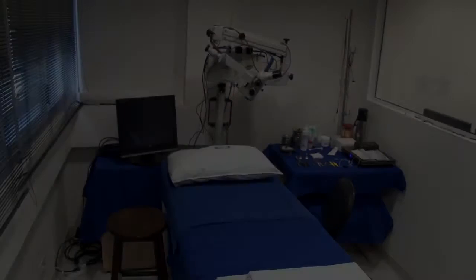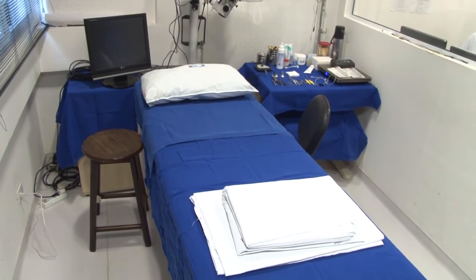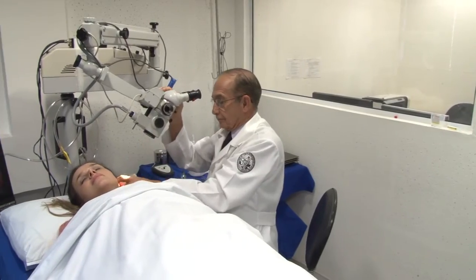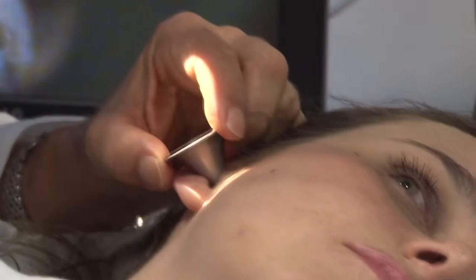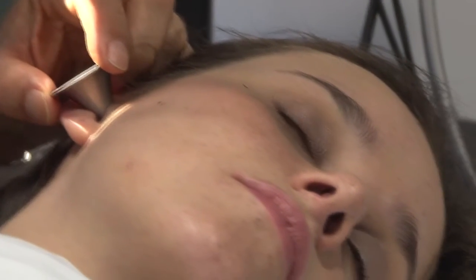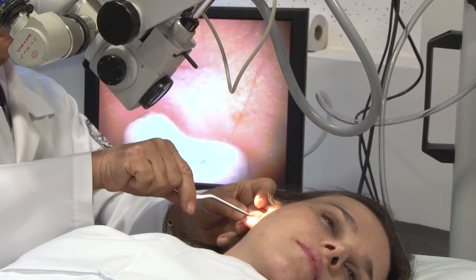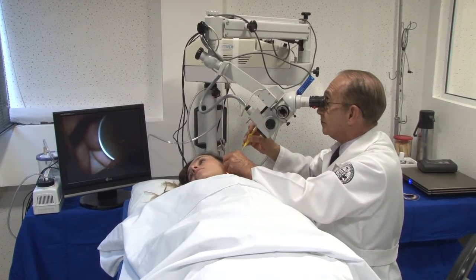Today we will show you how we do electrocochleography. Electrocochleography is mostly used in patients with Meniere's symptoms, but it may be useful in other clinical conditions. As it shows nicely cochlear microphonics, it is popular for studying auditory neuropathy spectrum disorder. Clinicians may use it as well as a complement for ABR when wave 1 cannot be correctly identified.